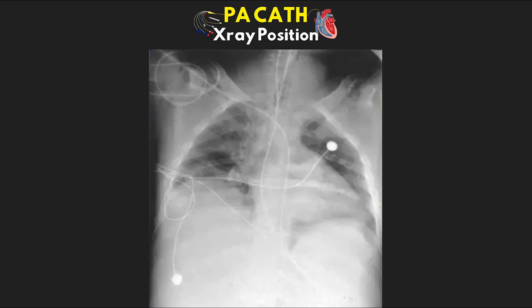Now here in example eight, take a look and see if you can identify what the problem is. In this example we actually have a subclavian approach. The problem is that they ended up putting it in the subclavian artery, and therefore, if we follow the path, instead of coming down along the patient's right side where our vena cavas typically are, we cross over the midline and end up going down what is the patient's aorta.